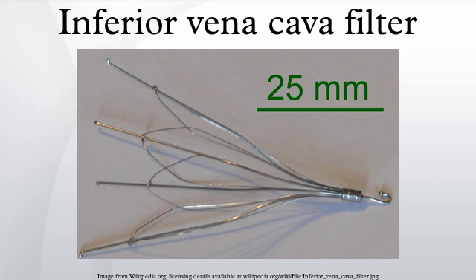Common issues relating to failure, to include death, include device-associated morbidity, device migration, filter embolization, filter fracture, insertion site thrombosis, perforation of the vena cava, recurrent DVT, recurrent PE, thrombotic complications, vena cava thrombosis. Less common adverse reactions. While these side effects are not common, many do report issues stemming from the placement and complication of the IVC while inside the body.